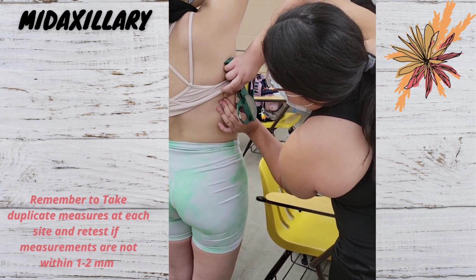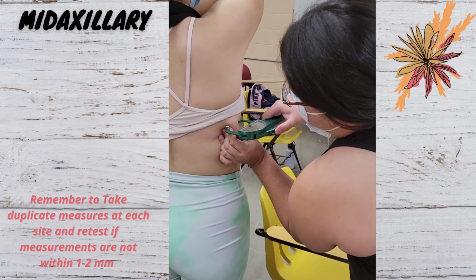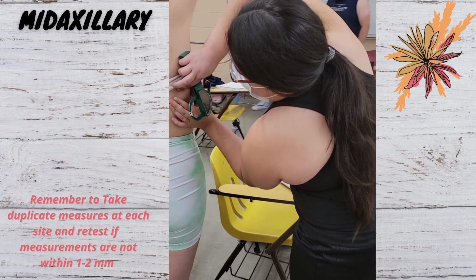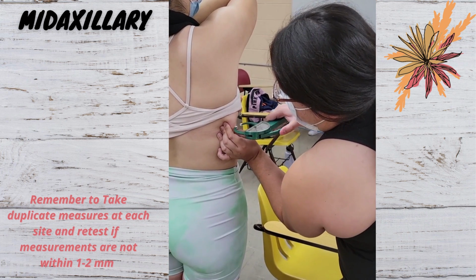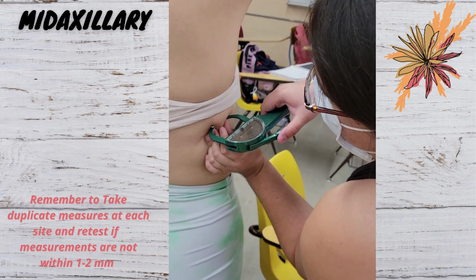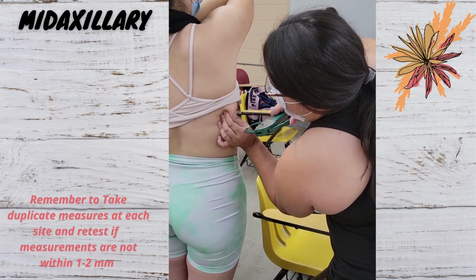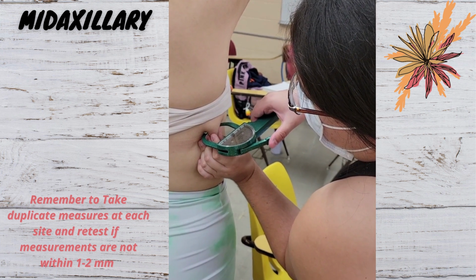When taking the right side mid-axillary site measurement, you're going to raise the arm of your patient above their head. You're going to pinch a vertical fold on the mid-axillary line, which runs directly from the center of the armpit down to the level of the xiphoid process of the sternum. You're going to use the skinfold caliper, be perpendicular to the vertical fold, then pinch and hold for 1 to 2 seconds, then record the measurement.